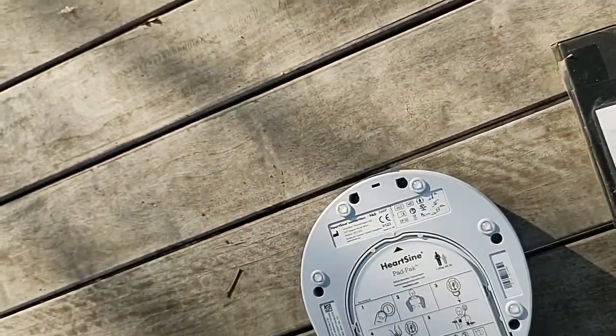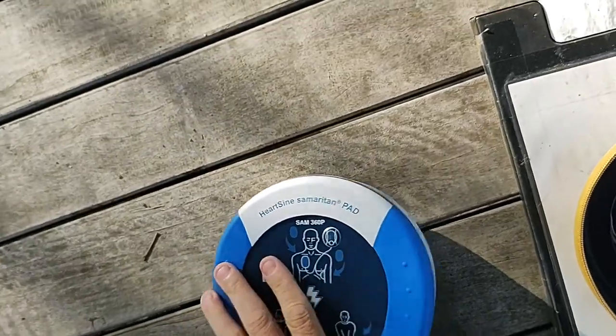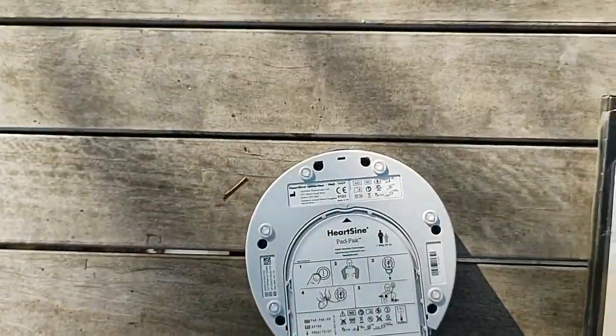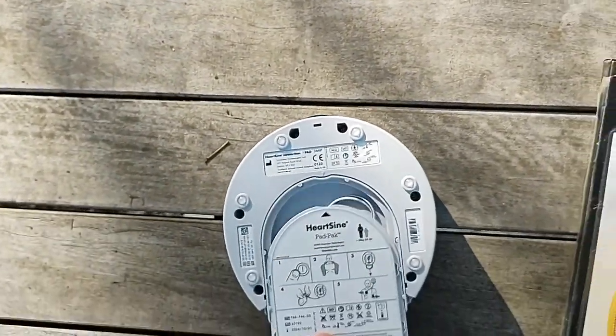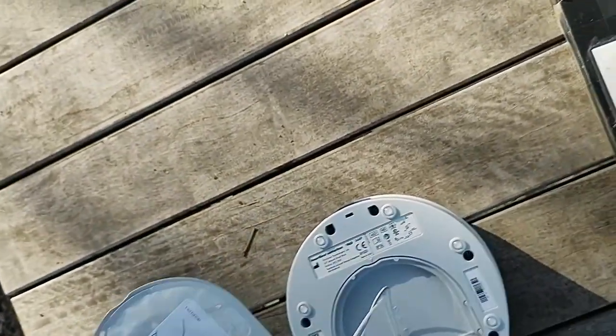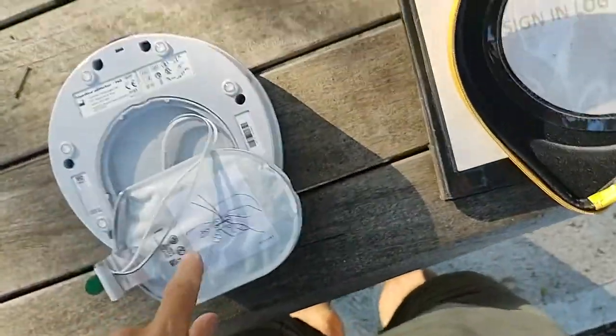The instructions say number one is to press the button — there's the button there, we're not going to do that now. Number two is to open up the shirt of the person requiring defibrillation. Pull out this section from the defibrillator.